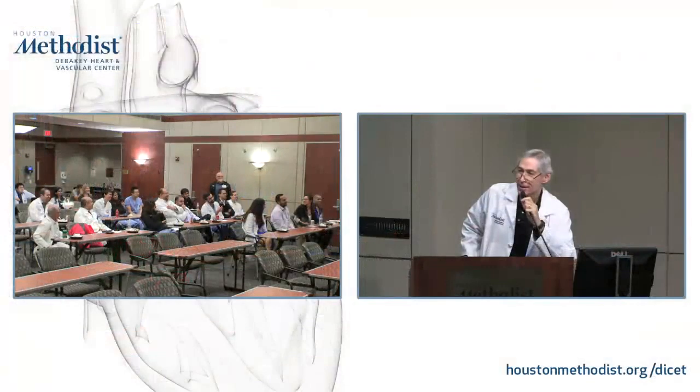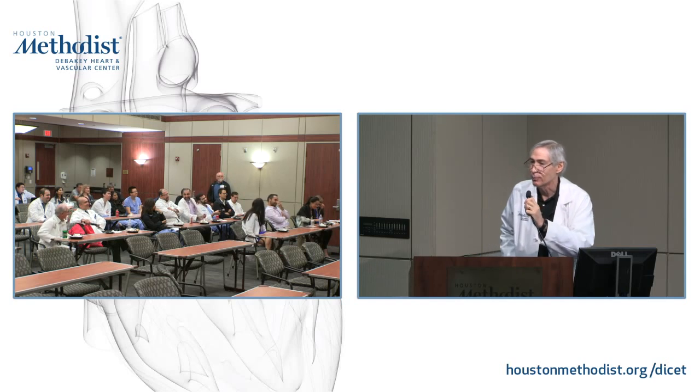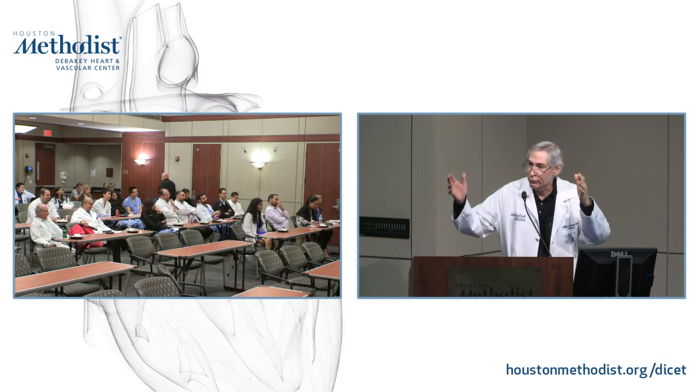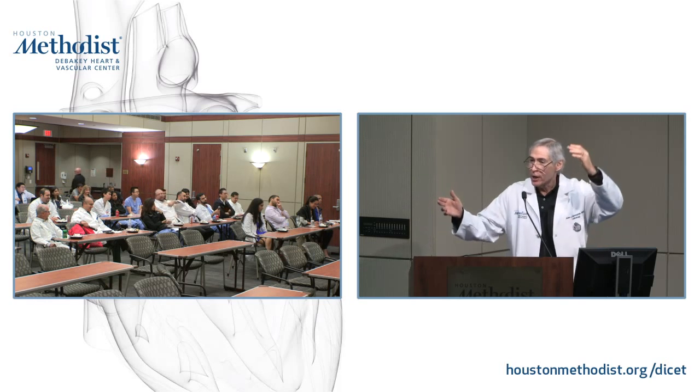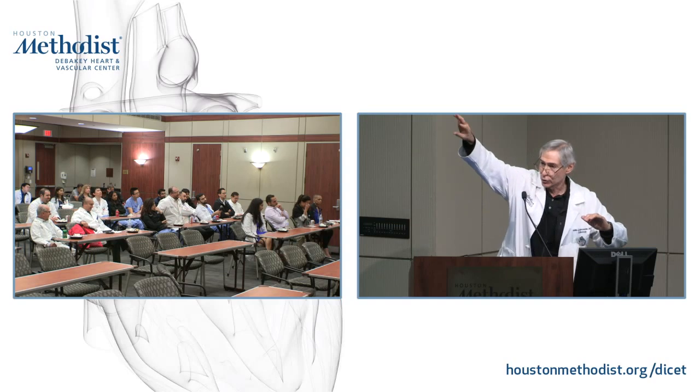Okay. So yes, you would expect sensitivity to improve, because of what I talked to you about with coronary flow reserve. If you're really able to look at flow along the entire spectrum of flow, you should be able to see disparities between normal and abnormal areas much better. So you would anticipate the size of the perfusion defect would improve, and you'd also anticipate that sensitivity would improve, right? But what about the specificity?